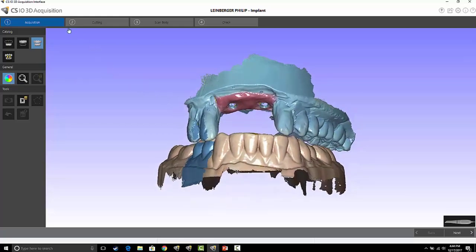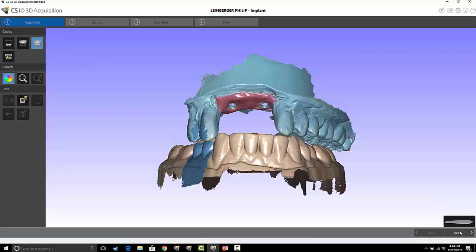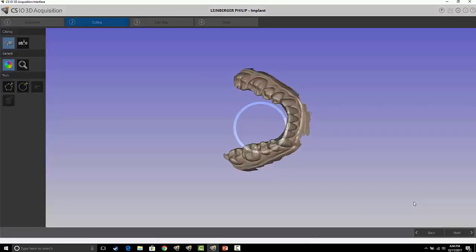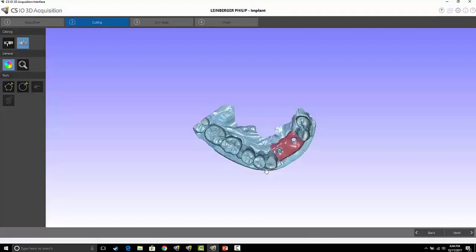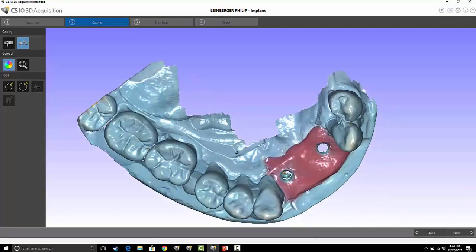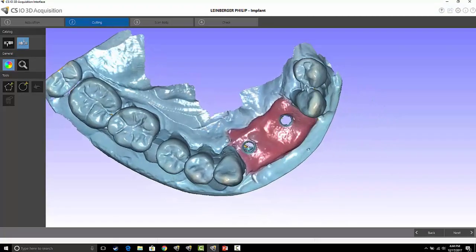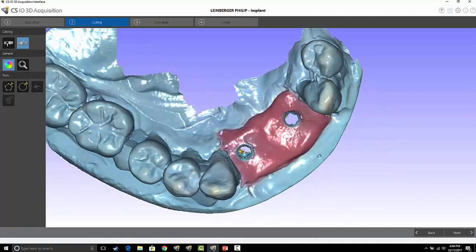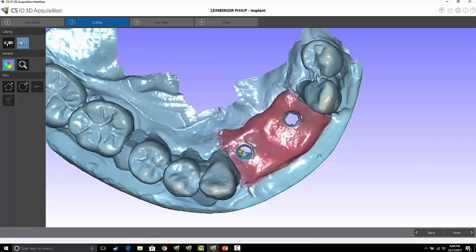We're in the implant workflow. You can see here I'm under acquisition, and the normal workflow is you scan upper, lower, and bite just like normal. I go ahead and select next, and I go to my implant arch and I can zoom in nicely where I'm looking at it down exclusively.